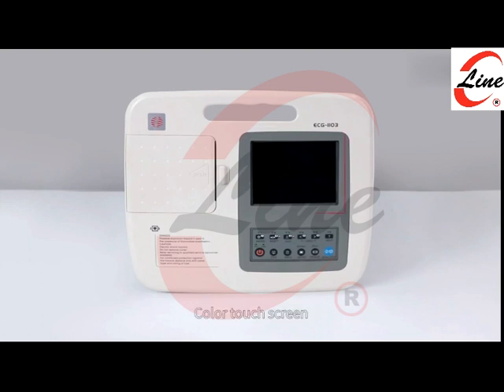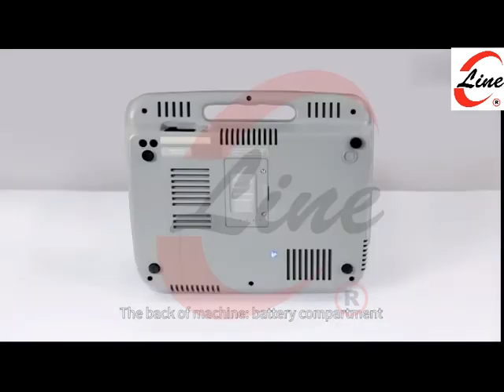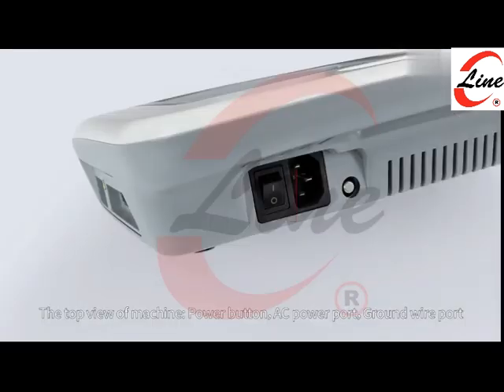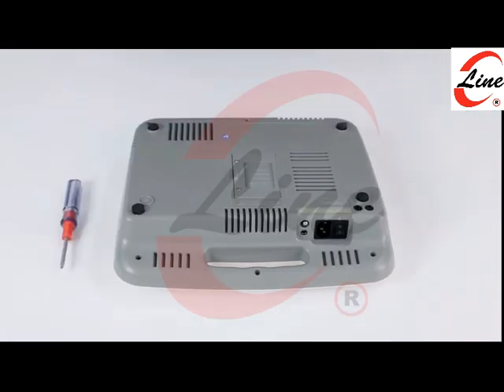Handle. Color touchscreen. Keypad. Thermal printer. The back of machine, battery compartment. The right side of machine. Patient cable connector. RS-232 port. LAN port. USB port. The top view of machine, power button. AC power port. Ground wire port.